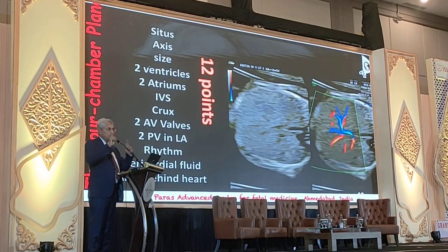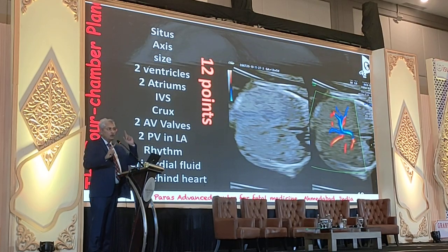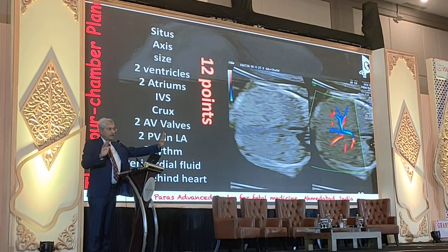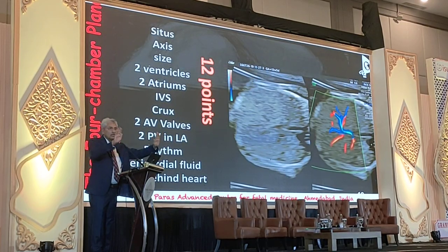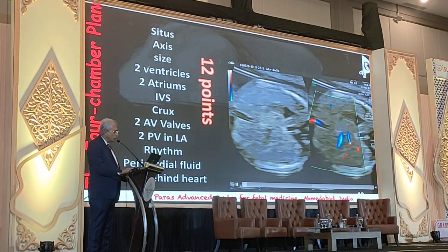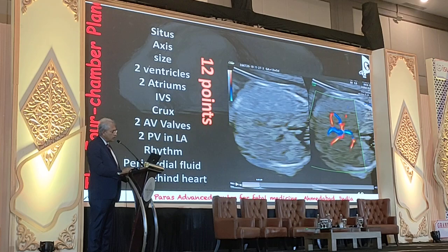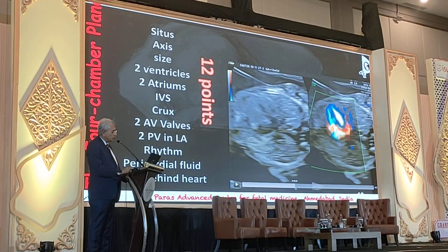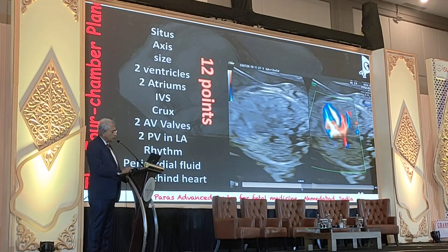The same thing is applied in the first trimester, but the problem is you don't see only grayscale or only color. You see adding HD flow, color, or a slow flow side by side. So one side you should have a grayscale imaging, one side you should have a color or HD flow, and you should be looking at the same thing. The stomach should be seen, you see the abdominal vein, you should see the apex of the heart, 4 chambers which are fine. You can see the pulmonary veins getting into the left atria.